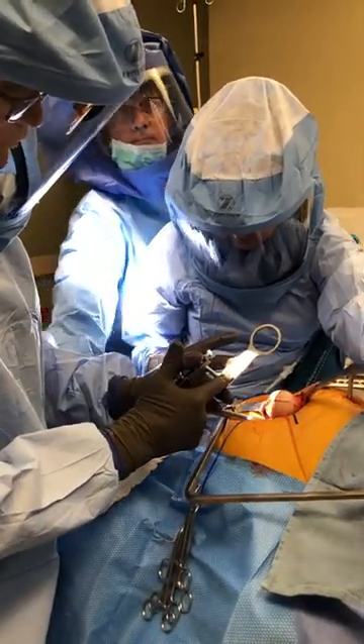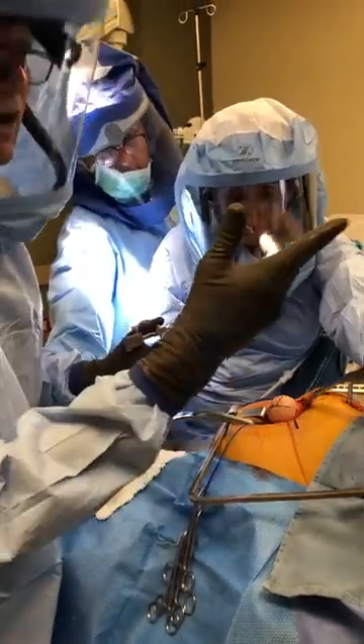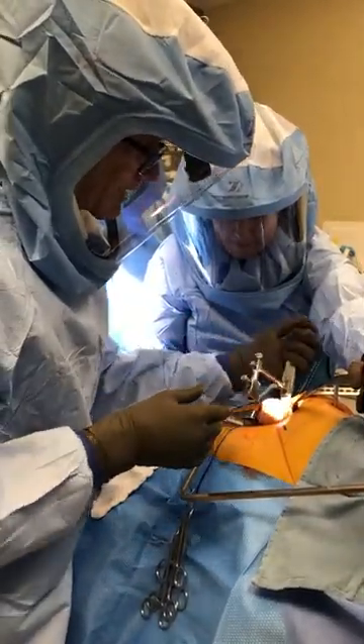We'll prepare the pin on the 44, and then cut on the 52, which is actually his head size. And then we could always downsize it later if we need to.